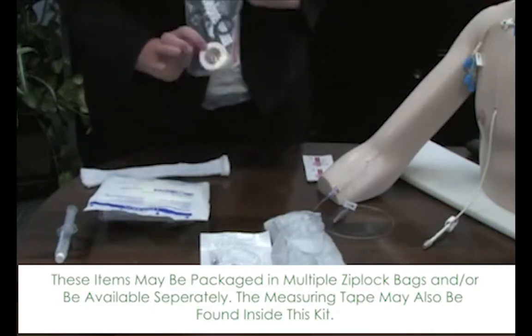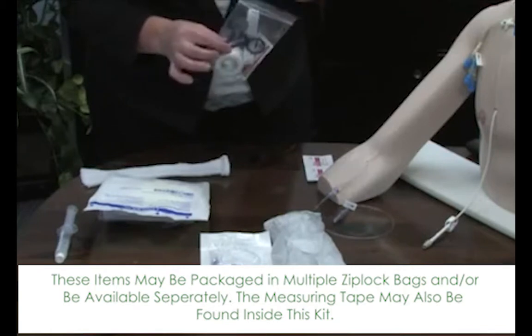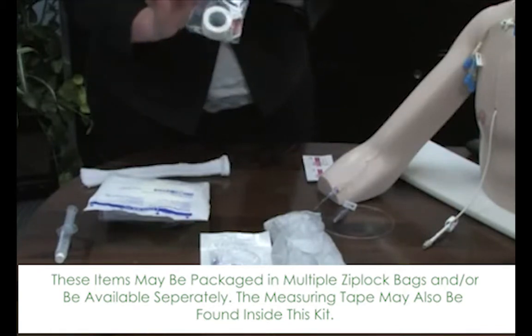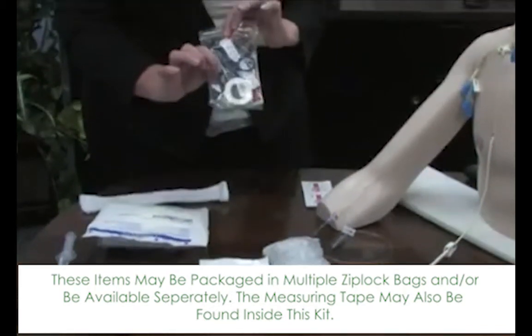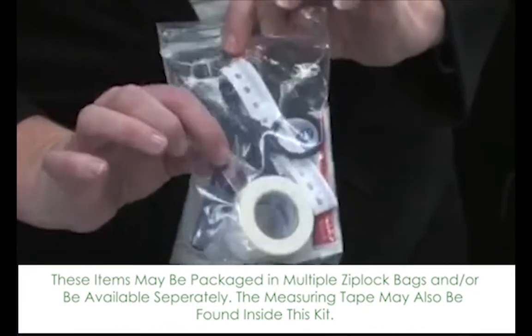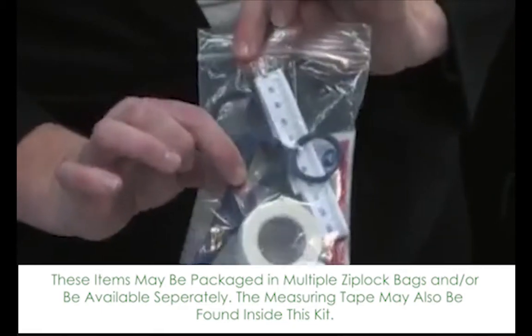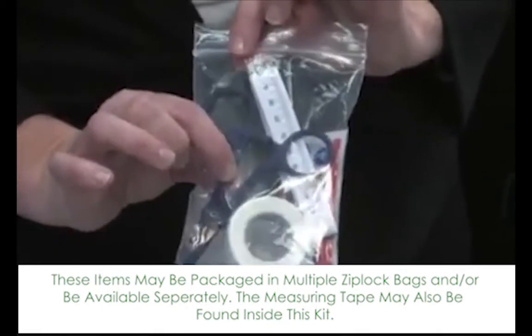And this little kit that we provide with every new patient has a couple of nice things in it. One of which is the little clamp here, that if you have any problems with a patient that has a hole in their line or has broken the line, this clamp can be used and is inside your supplies.